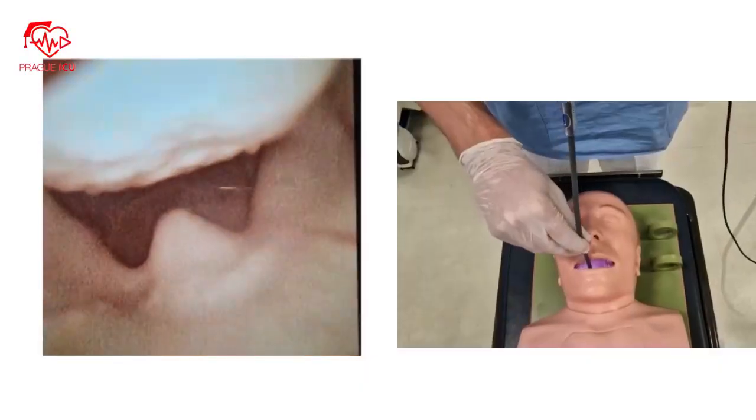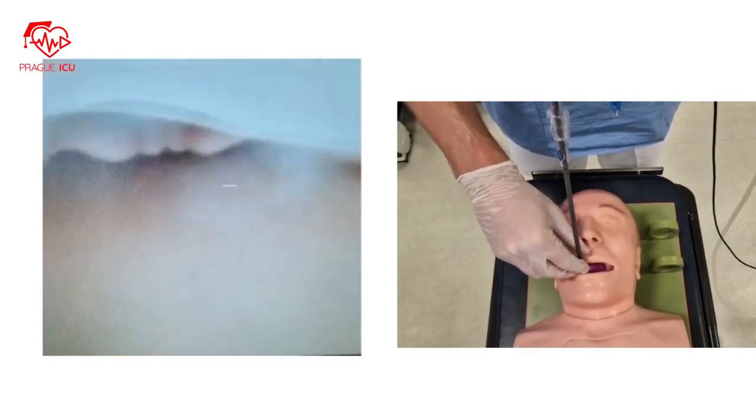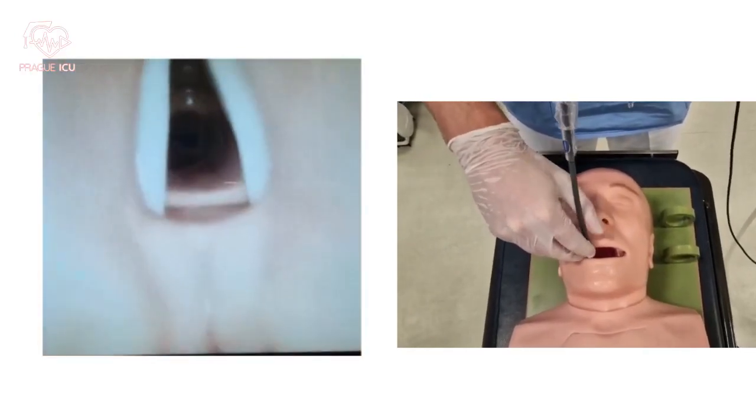Place the scope into the patient's mouth. Advance it until you see the epiglottis, then proceed further down and you will see the vocal cords. Continue advancing the scope through the cords to the trachea until you reach the carina.